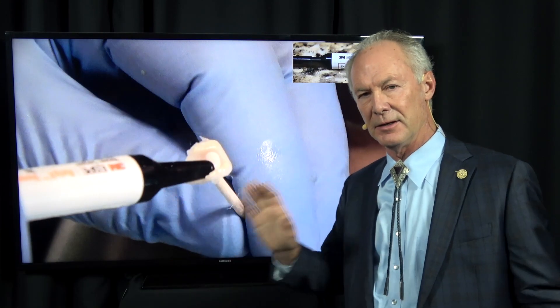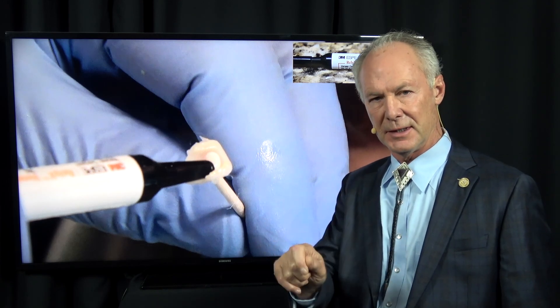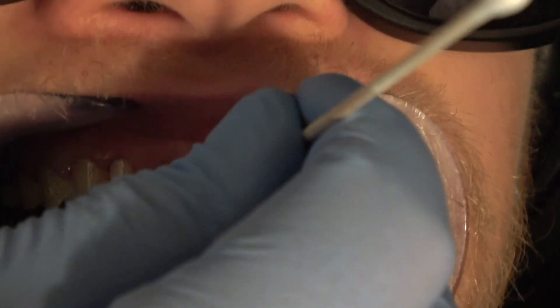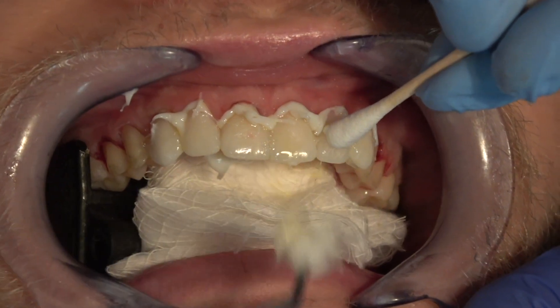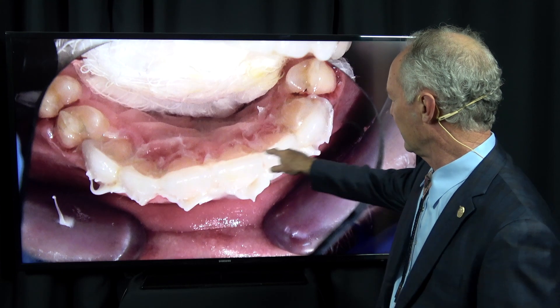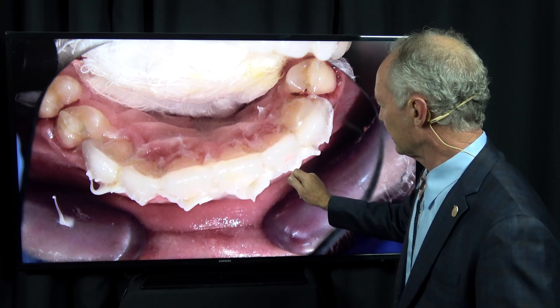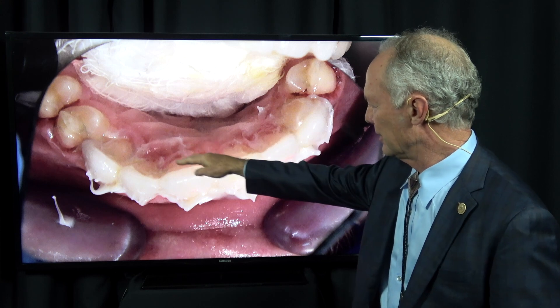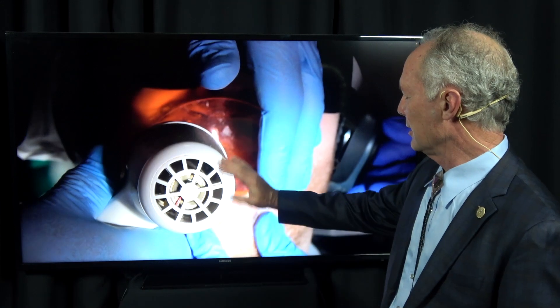I have not cured anything. I don't pick up a curing light until all the veneers have been seated. We're squirting the luting composite — the filled resin — onto the veneer and seating all the veneers. I'm wiping off a little bit on the palatal of the veneers to be sure everything is set, then pushing into place one more time so that a little bit of excess luting composite squirts out on the palatal surface. Now they're all in place.